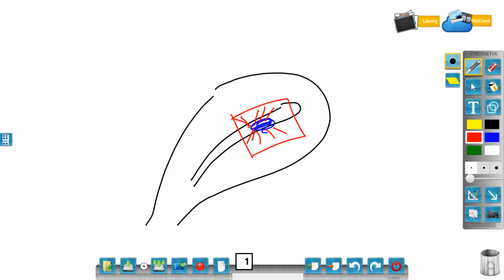On gray scale only, you cannot differentiate an RPOC from a blood clot. You have to go to the Doppler and you have to investigate on Doppler. If it shows flow, I mean the vessels, the color there, then it is a retained product of conception, RPOCs. So this is the brief answer for this.